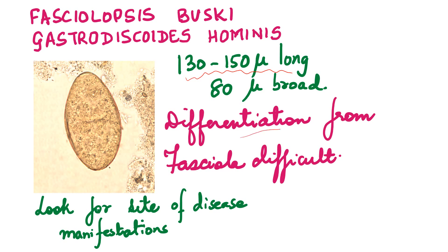Differentiation from Fasciola becomes very difficult. But sometimes you can appreciate a smooth ab-opercular end in Fasciolopsis, whereas in Fasciola species it is rough or irregular. Many times under the microscope it is very difficult to differentiate them. As I said earlier, to arrive at the likely cause of these eggs in the stool, look for what is the site of disease manifestation.